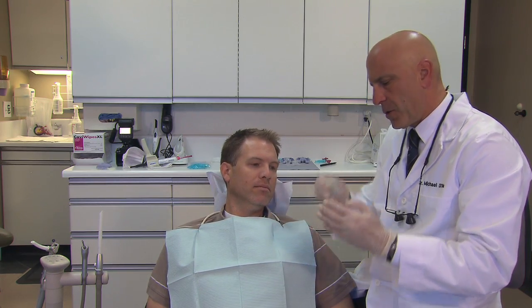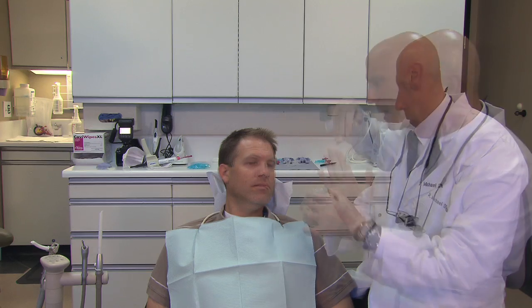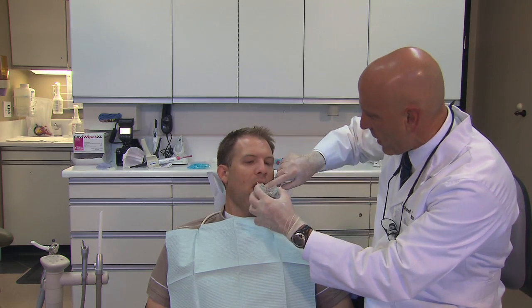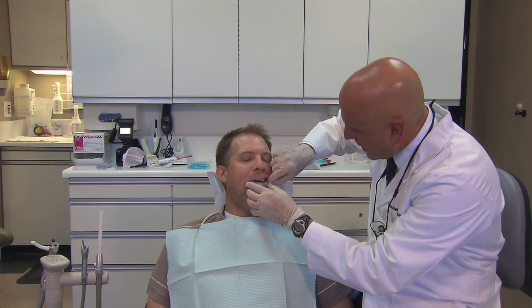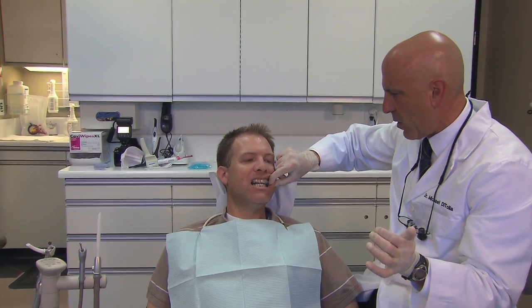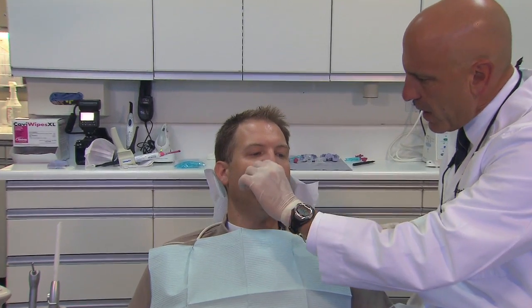This can all be done by your assistant, even though I happen to be doing it here on film. I'm always going to put it in myself the very first time just to verify that it does in fact fit and see if there's anything funny about it. Kind of like with a partial, just want to make sure that we put it in for the first time. Usually they'd have a mirror holding it up, but we're filming it, so we don't have a mirror.